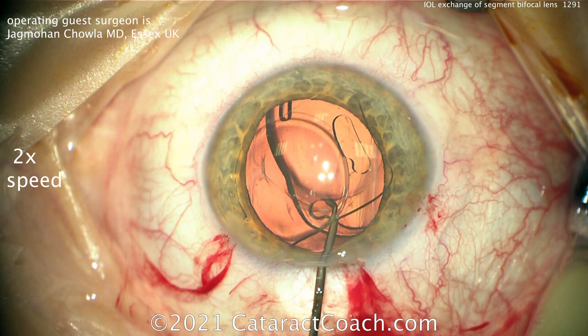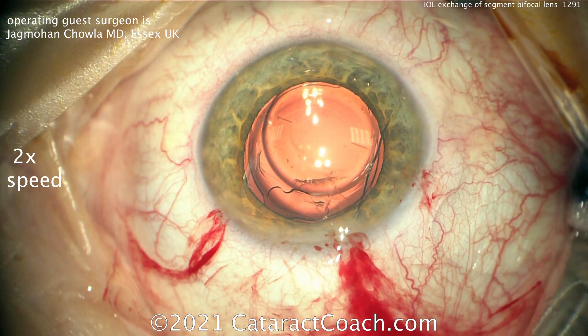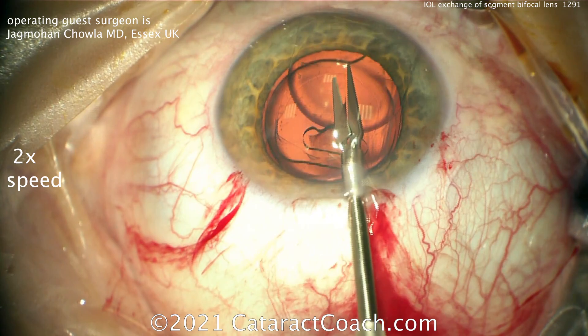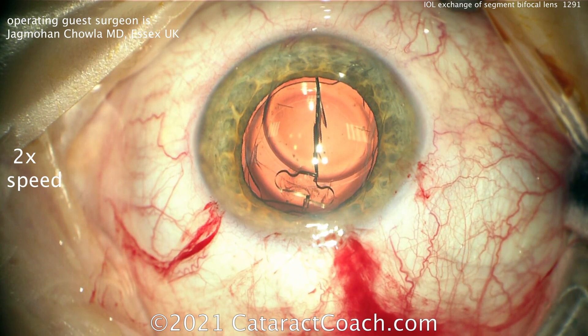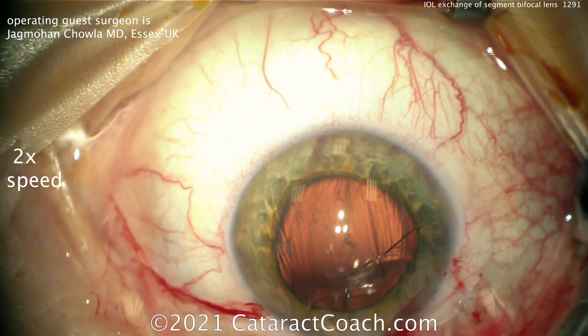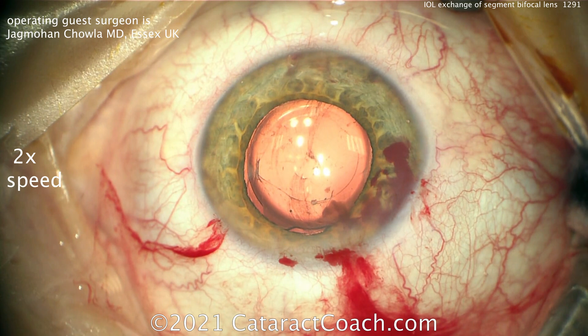Now to remove the old lens from the AC. I like the twist-and-out technique, but if it's a silicone lens it can be very slippery when coated with viscoelastic. He's using micro scissors to cut the lens down the middle — use a Sinsky hook on one end so you can cut across it more easily. He's cut not 100% of the way through — just about 80% — so it's still attached. Then grab one end, rotate a little, bring the other end through. Smart to not cut all the way through. And there's the lens removed in its entirety.